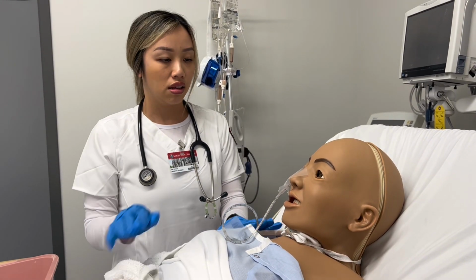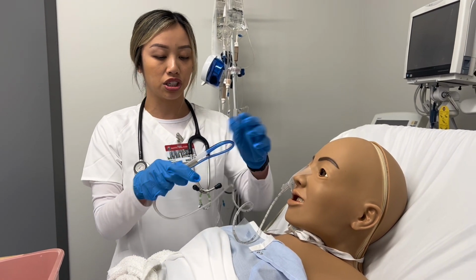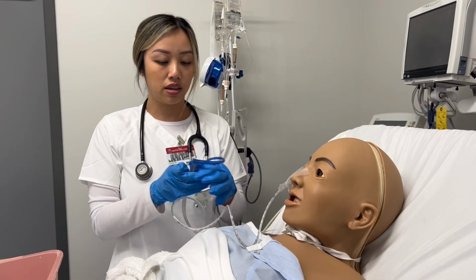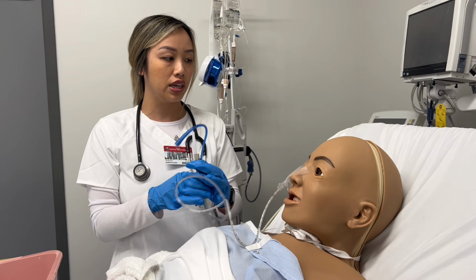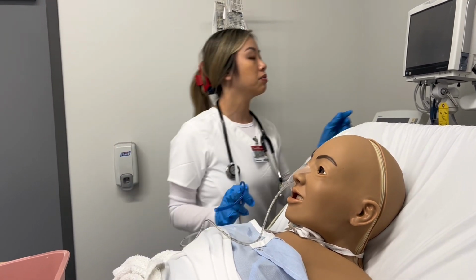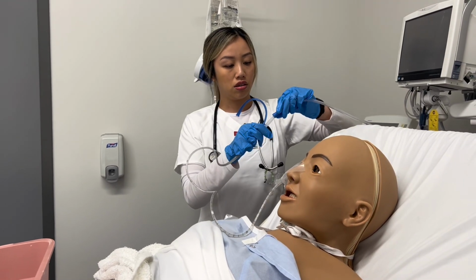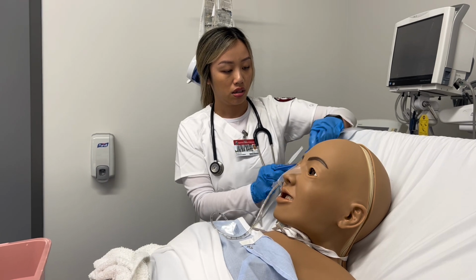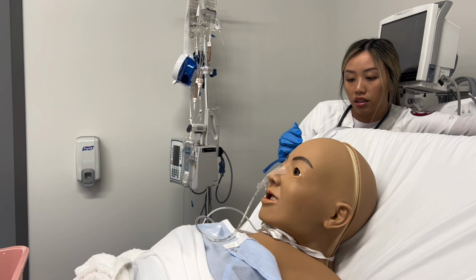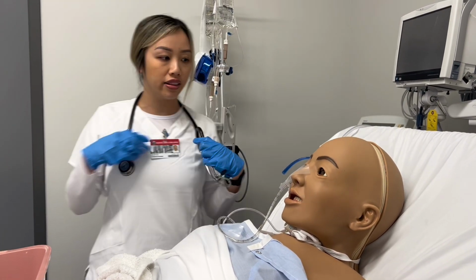Okay, all right, and then I will go ahead and attach now the suction to suction, and I would have it be between 80 to 150. It looks like the doctor ordered it to be at around 100, and it's going to be for intermittently. So it's going to go here, and it's going to be for intermittently. So then it's on intermittent there.